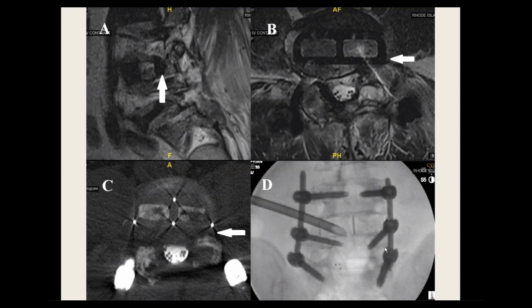So to summarize, we've covered herniated discs, fractured bone. We've covered PEEK implants compressing the exiting nerve. And we've also discussed heterotopic bone formation after lateral fusions. So these are all complex complications after minimally invasive complex spine surgery that can be remedied with endoscopic spine surgery.